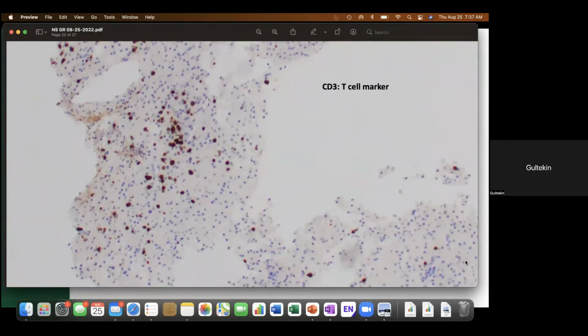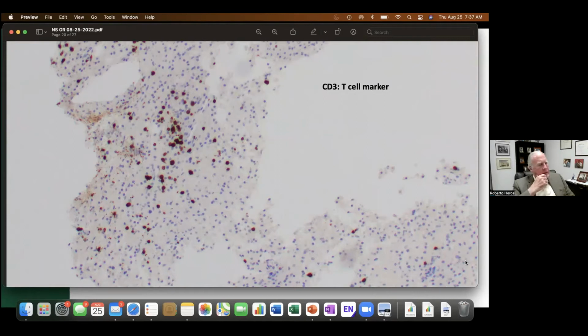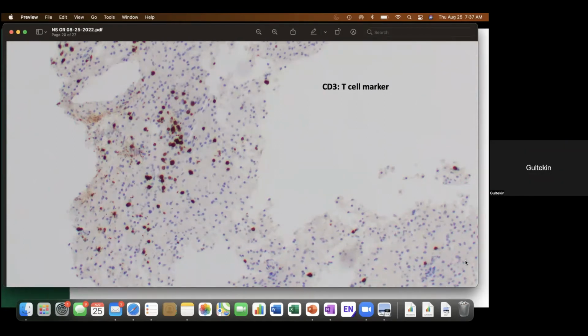Yeah. So there's also, I talked about blood vessels and perivascular lymphocytes. There is some sprinkling of mature T cells here in the parenchyma and in the perivascular areas. This can be seen in various demyelinating conditions. Of course, it can also be seen in encephalomyelitis, if that were the case, or even paraneoplastic disease. So in and of itself, it's not specific, but it is a part of the demyelinating process.